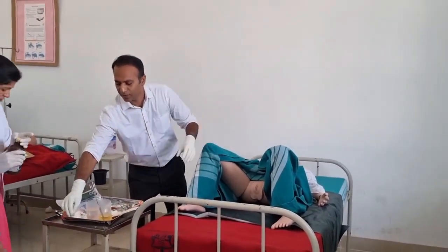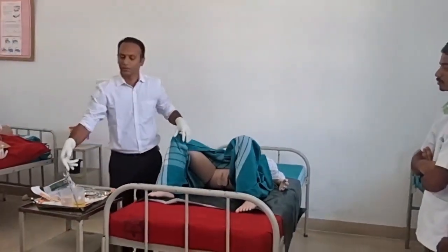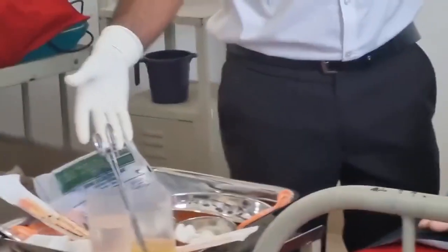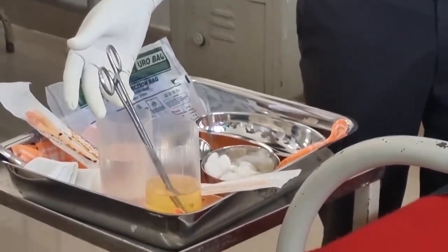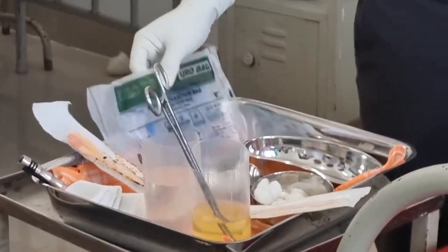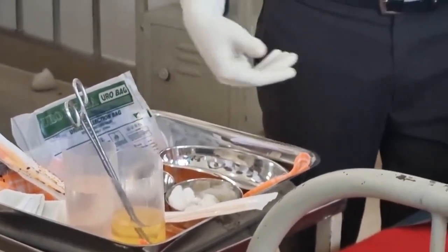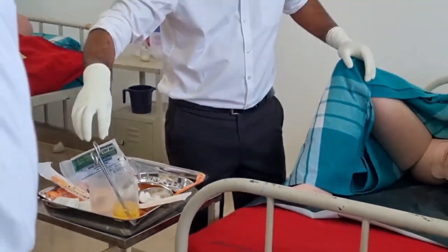Focus here. We already have the required articles assembled near the patient's side. We have sponge holding forceps, sterile water, Easyfix for fixing the catheter, the sterile catheter, lubricant, xylocaine jelly, and a kidney tray to collect used sponges. Okay, let's go with the cleaning procedure.